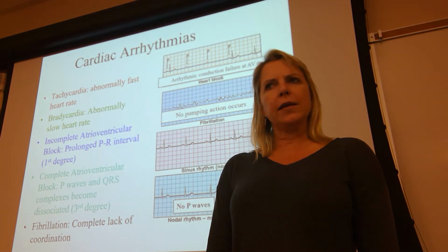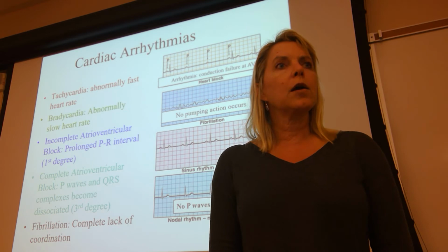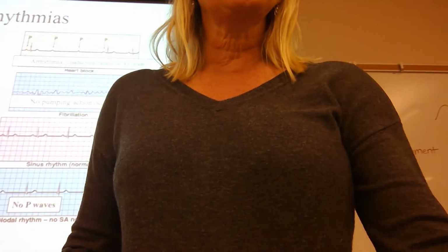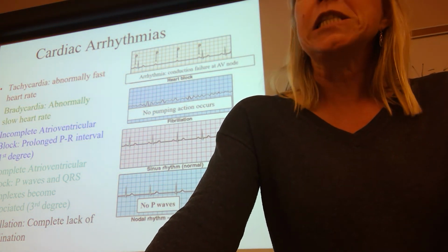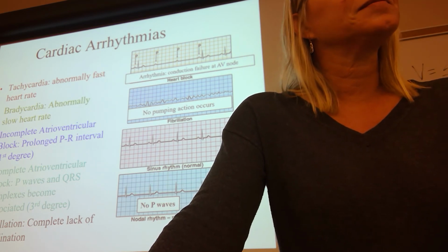Really? That's your answer? You gonna stick to it? Yeah, that's the answer. That's why. Oh, so what now, brown cow? If I have a patient at third degree AV nodal block, if I'm getting a P wave after P wave, and there is no QRST obscuring it, why don't I see it? So clearly that's not the complete answer, is it?